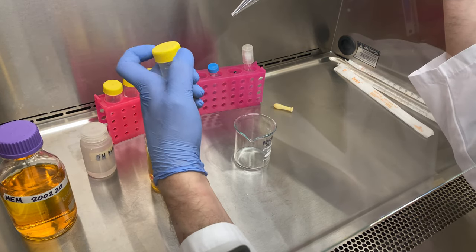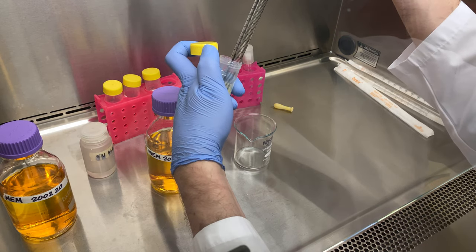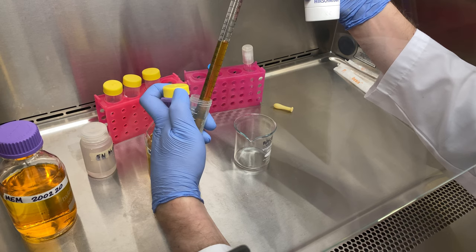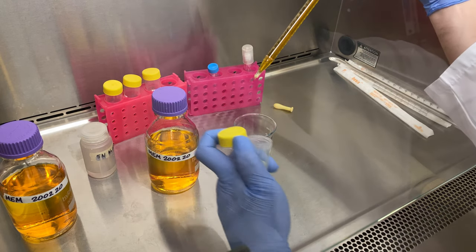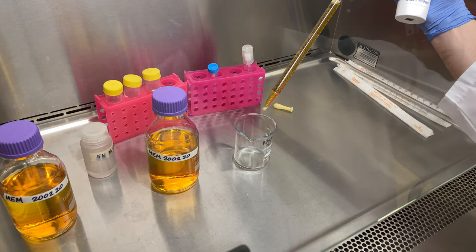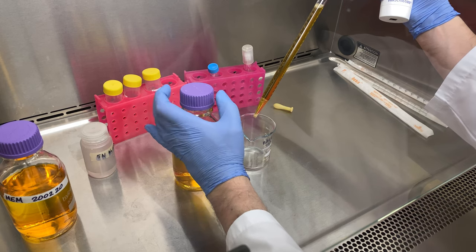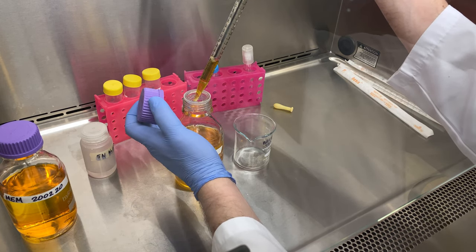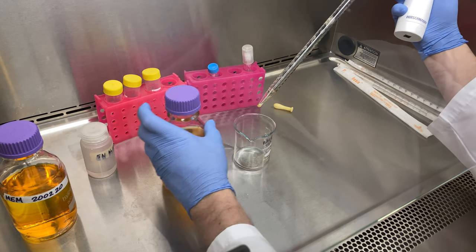You cannot freeze a 50 mil aliquot in a 50 mil tube — the water inside will expand and pop the tube off. So I've thawed out a 500 mil bottle and made 25 mil aliquots for freezing. As a result, I will be adding two in. Please note, when you suck up your serum into your pipette, it tends to drip out the bottom, so make sure you hold your pipette over your waste beaker.